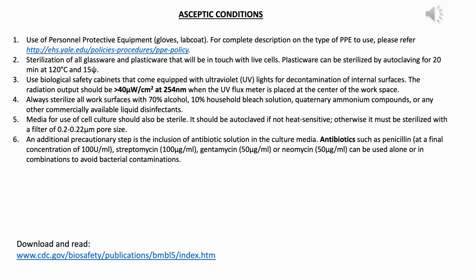Because when you have contamination, then this bacteria or fungus inhibit cell growth because they compete with the nutrients that are present in the media, and your media is essentially nutrient-rich media. So it is a very favorable media for bacteria and fungus to grow in. So if there is any relaxation in your aseptic maintenance, then these bacteria or fungus can easily grow there, and because they have a smaller doubling time, they will be growing at a much faster rate compared to your cell line.